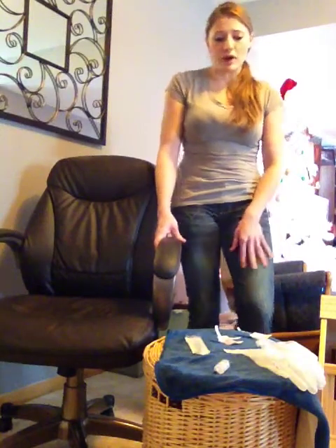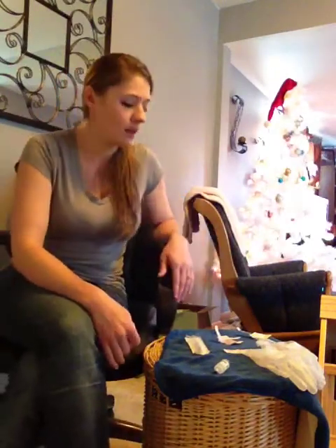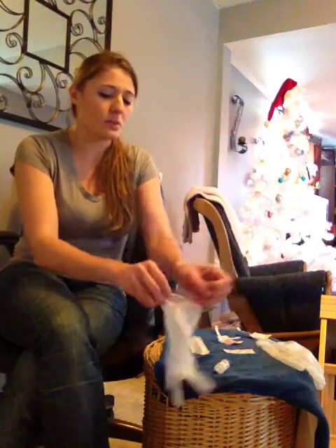We'll get into the Z-trac method here, and I'll give you a demonstration on how a Z-trac injection is given. The first thing you want to do is wash your hands, make sure that you have clean hands, and put gloves on. So the first thing you want to do is put on our gloves.